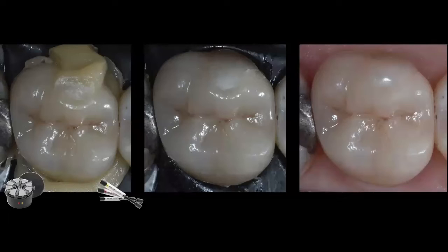So I've heated my composite 3 to 5 minutes, 155 Fahrenheit. I inject the composite within the intaglio surface of the restoration, and now I'm pushing that restoration to fully sit on my preparation, and you can see how it is expressing itself out of the margins. It is the easiest composite to clean. Again, if you've never done this, please give it a try.